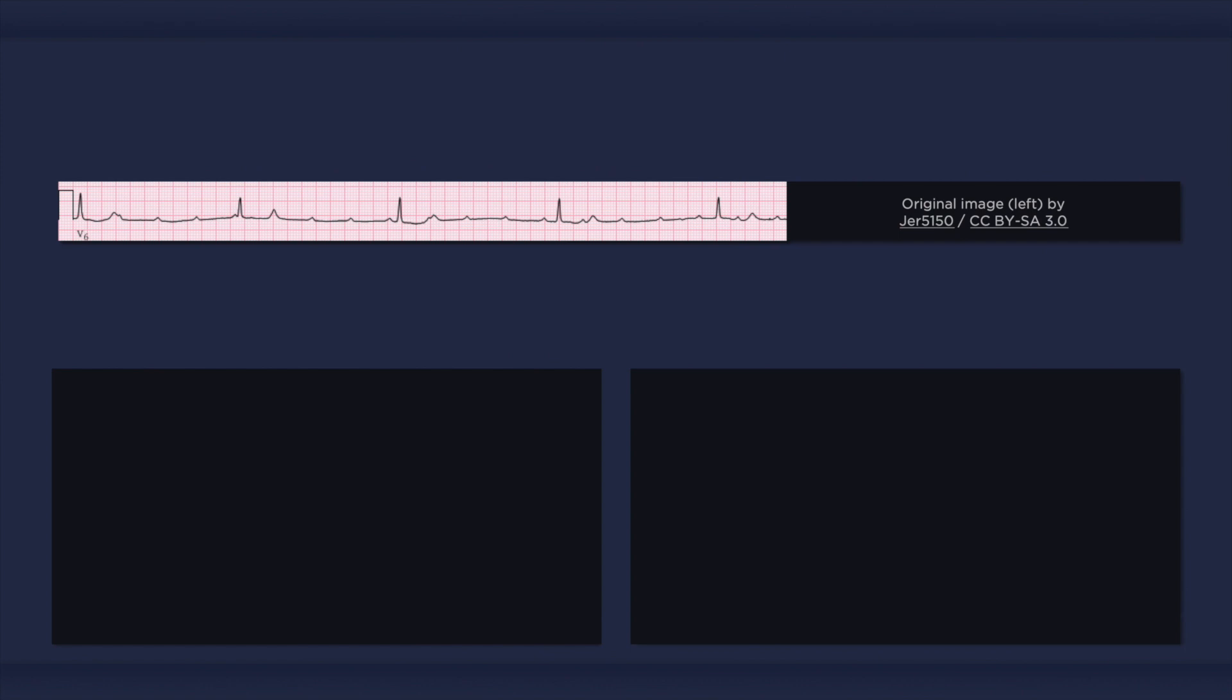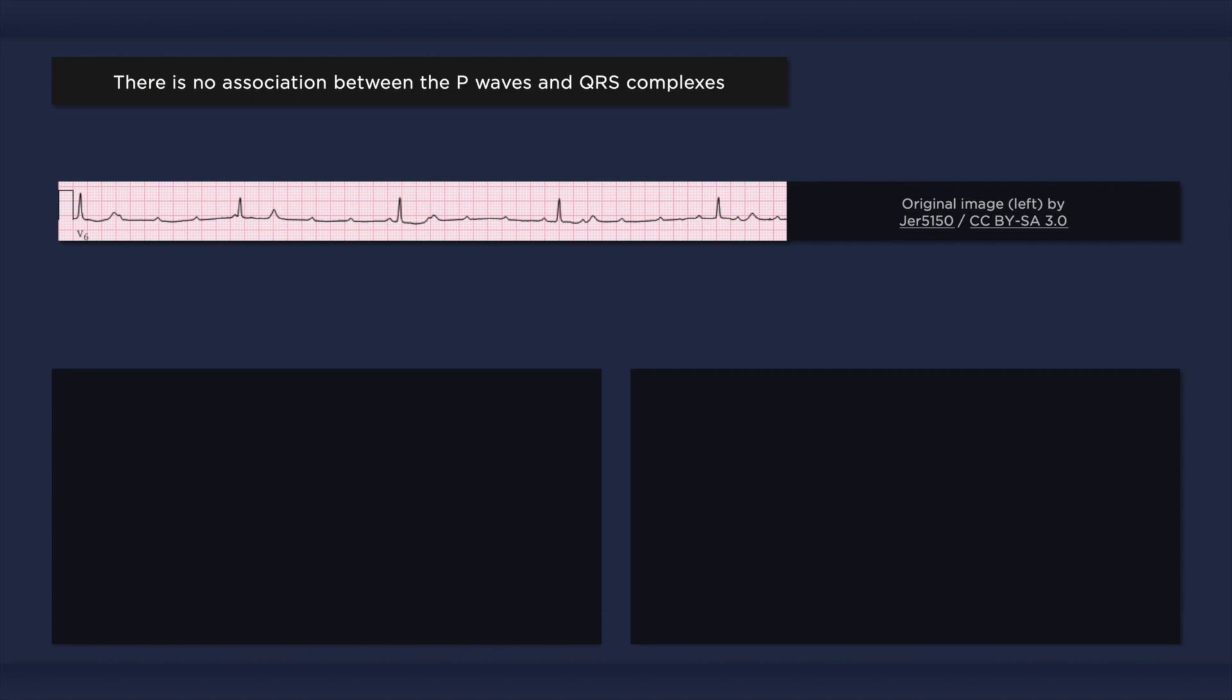With complete heart block, electrical impulses from the atria do not reach the ventricles. Instead, the atria and ventricles are controlled by independent pacemakers. This results in asynchronous activation of the upper and lower chambers of the heart. This is reflected on the ECG as atrioventricular dissociation, in which the P waves and QRS complexes occur completely independently of one another.